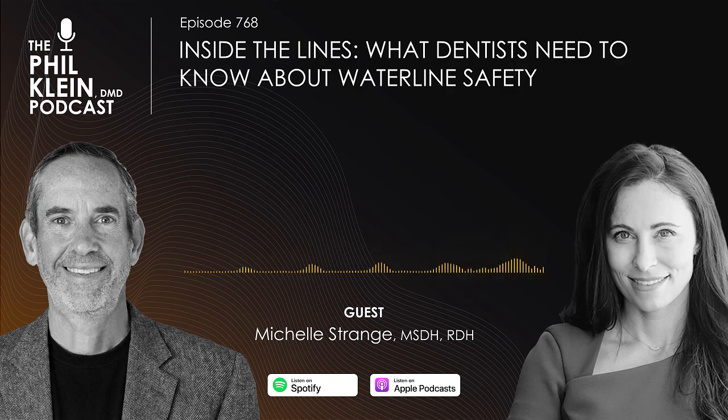I used to call our ultrasonic bath the cesspool of the office, like it has just got everybody's gunk in that ultrasonic bath. But I'm really starting to call your dental unit water lines and your ultrasonic bath the cesspool, because it is just a breeding ground for these microbes. And we do have a major problem in our industry. It is something I think Shannon Mills called the dirty little secret of dentistry for years, because we've been only kind of treating them.